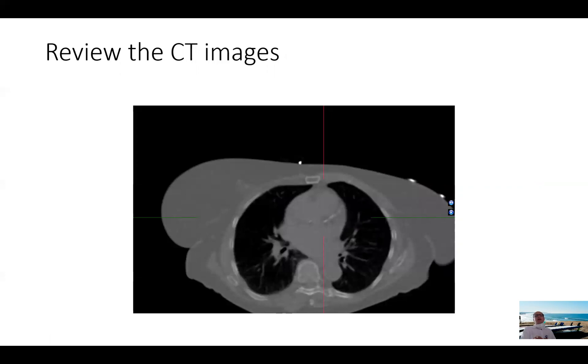Next step is to look at the CT images. And here we can see that the CT images, despite the poor quality of the CT images we do for these studies, very often we are able to see calcification as you can see in the LAD system. That's something we report to indicate presence of chronic calcification, especially in patients with no previous coronary artery disease or no previous revascularization. And then we scroll up and down with this and look at lung nodules, extracardiac findings that are worrisome or need to be addressed during this test.